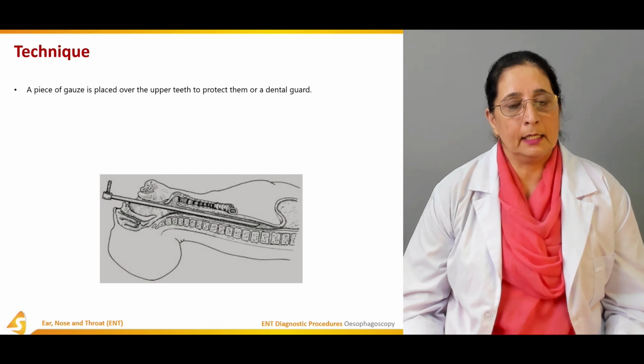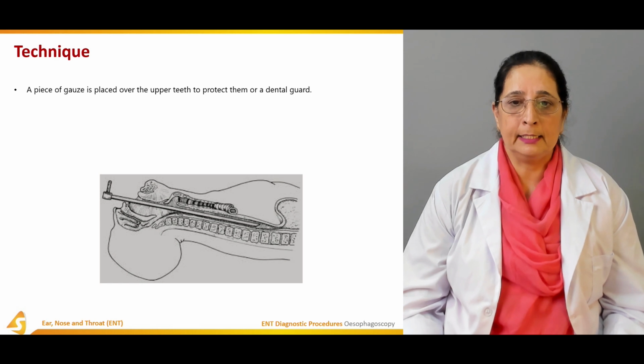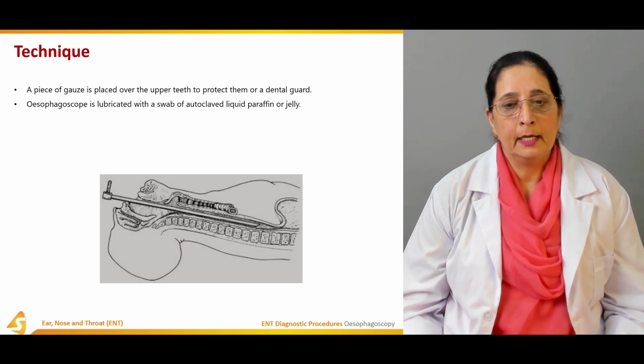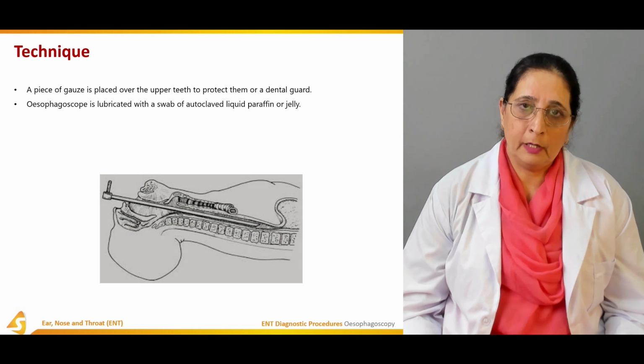Technique: a piece of gauze is again placed to protect the teeth from any injury. The oesophagoscope is lubricated with liquid paraffin or jelly.